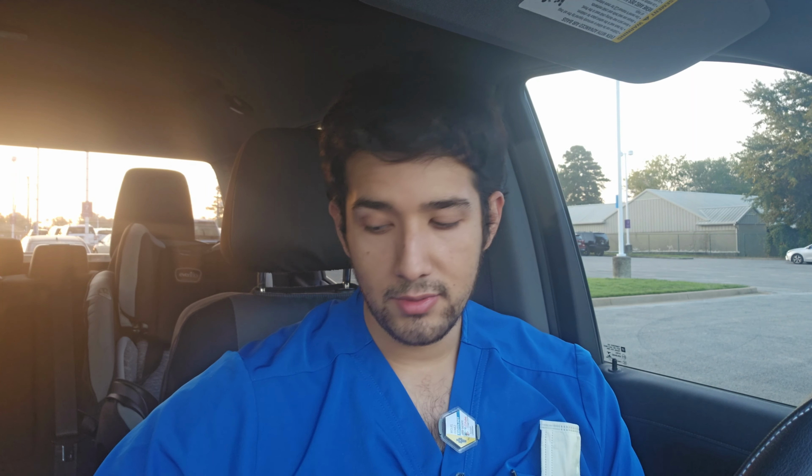Occasionally the network will go down, like your whole hospital network, and you'll be on downtime and you have to manually put the exams in and push them to the PACS. Sometimes your own portable machine has its own internet, and sometimes it will not be working. The easiest solution is to just do a lap around the hospital and it'll reboot and connect. Sometimes you have to manually go in there and reconnect it, refresh it, or disconnect and connect. Almost like the Wi-Fi at home. You have to deal with that kind of stuff.